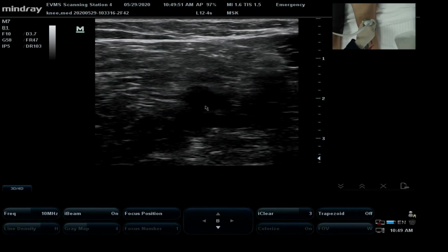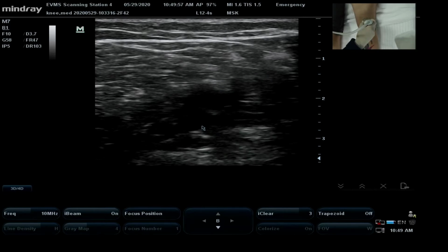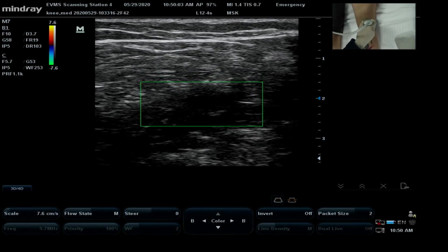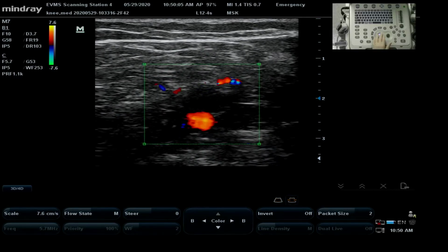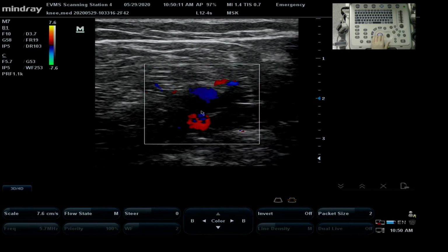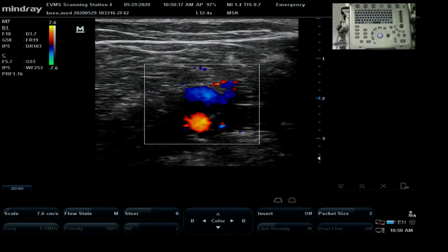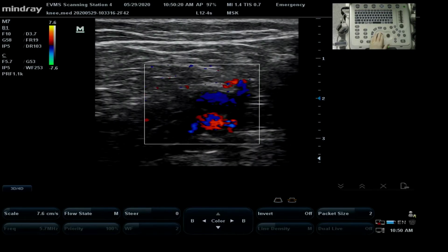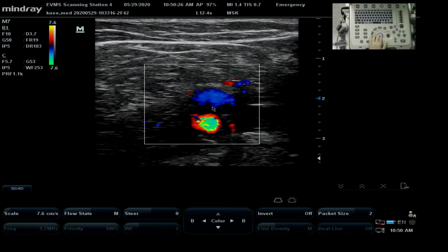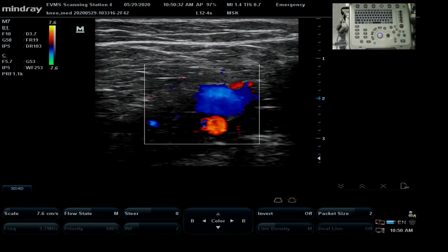These are the popliteal vessels, and typically the vein will be on top of the artery, and if I put color flow on here, you're going to be able to see the flow through those vessels. And if you're still wondering, you can see that pulsatility of the artery and not so pulsatile on that vein. I can augment that so you can see a little bit better. If I do a little bit of augmentation, you saw that that filled right in. The augmentation that I performed there was just putting a little bit of pressure on her calf, just a little tap, and that augmented it.